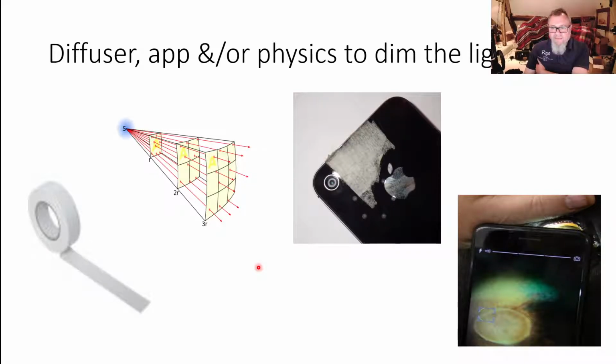One of the issues we have is that the phone lights are very, very bright. That's very useful because it allows us to dazzle our patients, for example, to see whether they are visual through a cataract. But it's often too bright for them to tolerate looking at the fundus or even the lens. So you need some way of reducing the light intensity, either with a diffuser and 2 or 3 layers of microscope tape, maybe all you need to use.